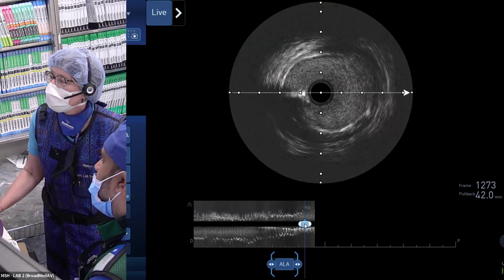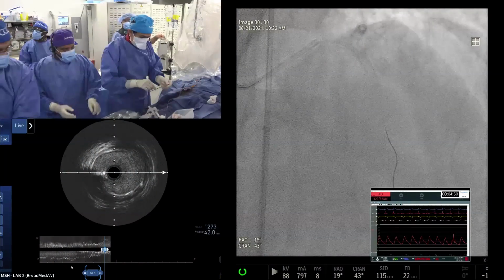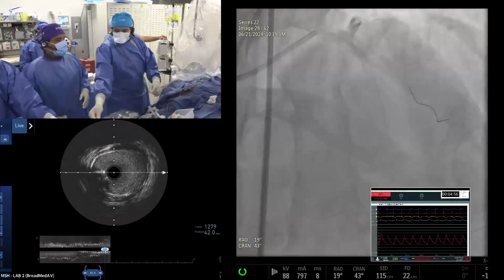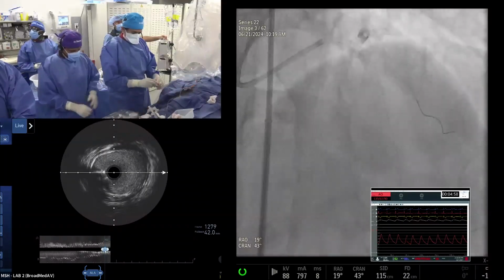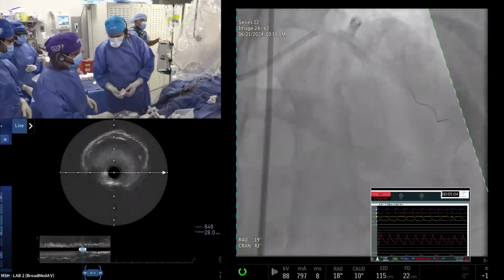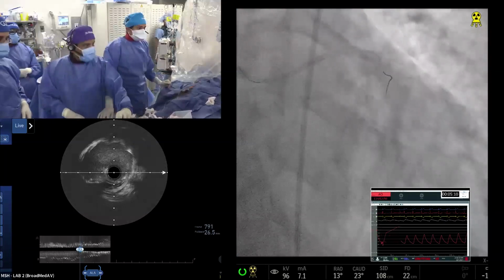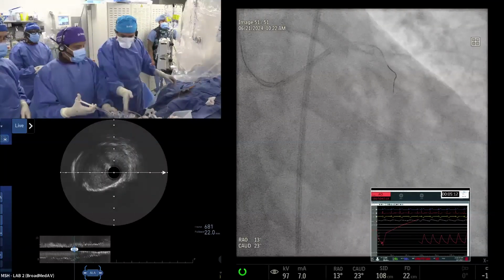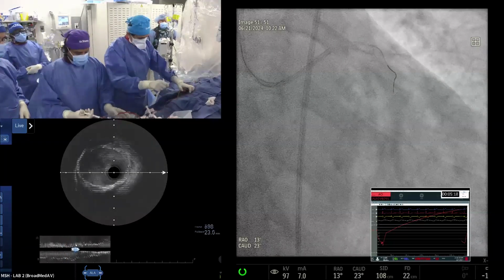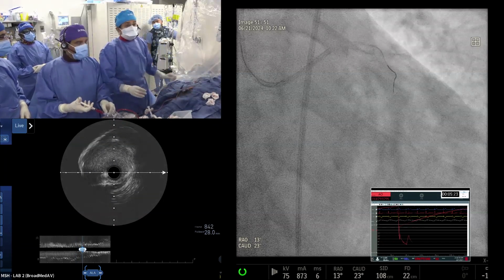Okay. So let's ask our experts here, do we need to do any post-dilatation? The wire from the diagonal has been taken out, and angiographically it looks beautiful. Post-dilatation is entirely up to you. I feel the catheter was a little oblique, that is why we got the appearance of malapposition. I think it looks good to me. Is there any pinching of the diagonal? Yeah, there seems to be some pinching of the diagonal. Is it okay to leave it like that? That is healthy. That's a normal look of the side branch after provisional stenting.